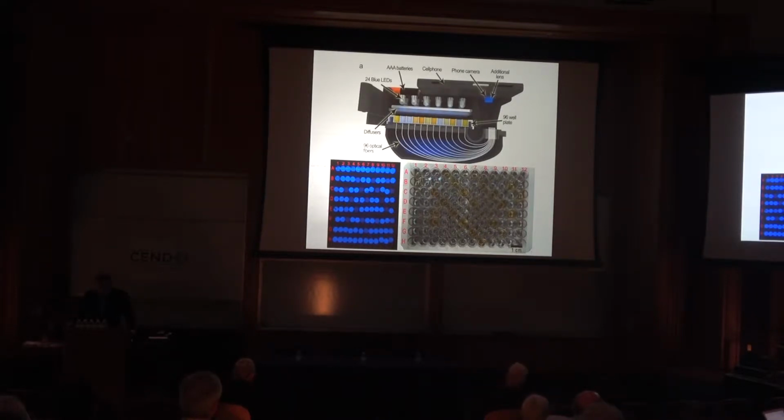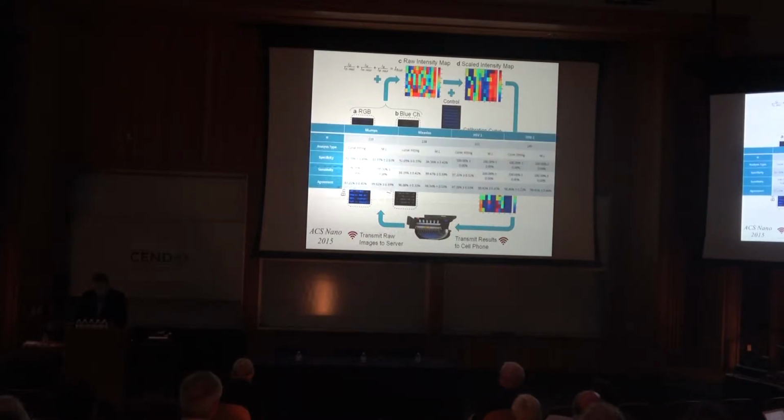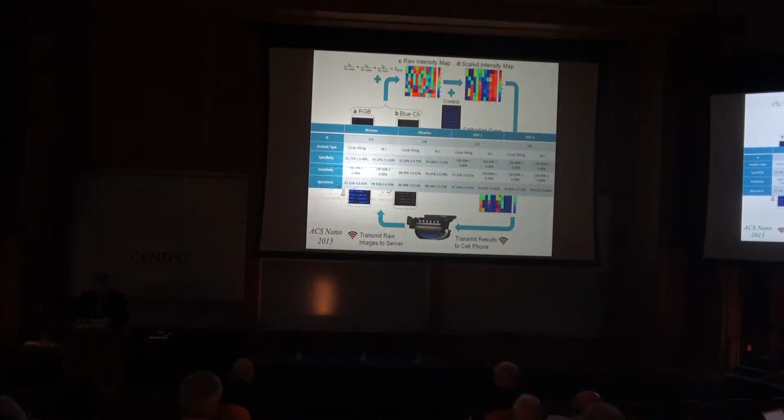testing. And we've achieved extremely good performance matching the results of an FDA-approved device in terms of specificity, sensitivity, and agreement. Processing those transmission images of those fiber bundles and some machine learning geared toward each one of these tests, we've achieved almost FDA-ready data without any very major or major errors made for diagnostic purposes. So it's indeed not only mobile and cost-effective, but also has the analytical sensitivity and performance that is coming very close to FDA-approved devices, as we've shown in this study.